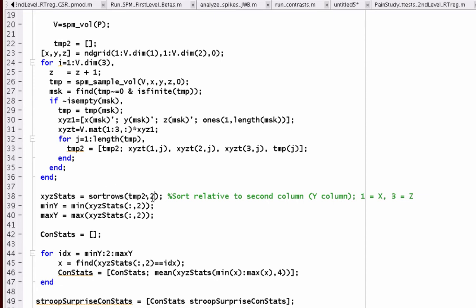You could change this number right here to one if you wanted the X direction, like left to right, or Z if you wanted ventral to dorsal, anything like that. And then it sorts that according to that, and we're going to be taking the mean across, for each slice, there's a certain number of voxels activated in that mask for each slice. We're going to average across all of those for each slice. So that's what it's going to look like.